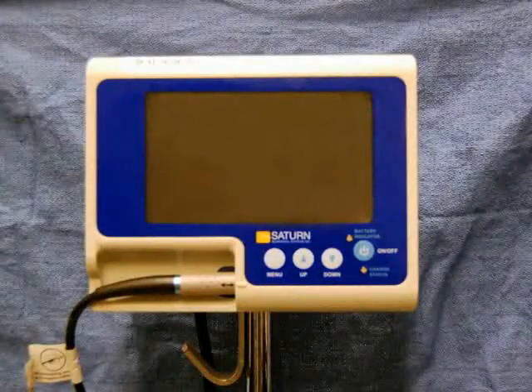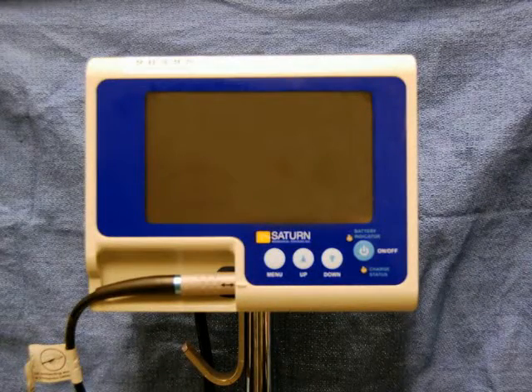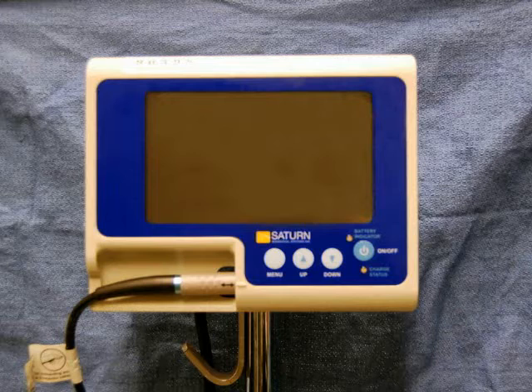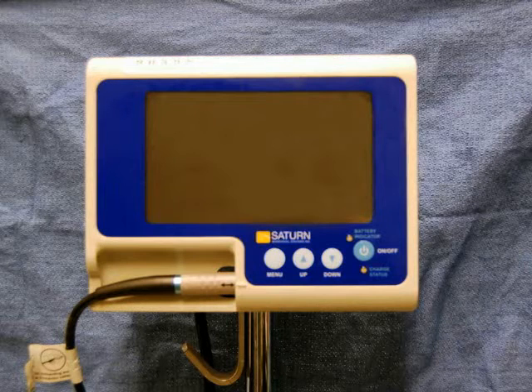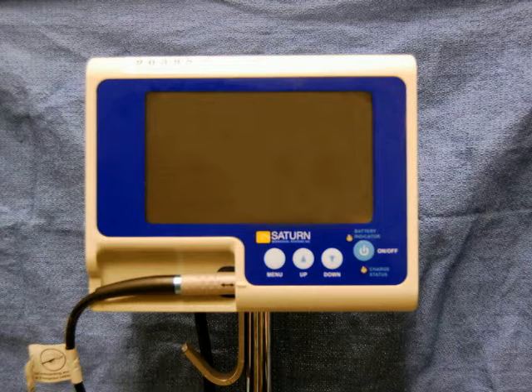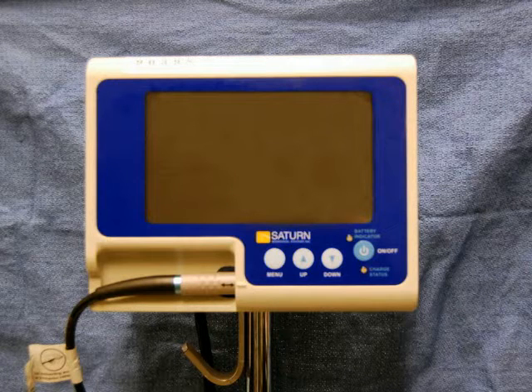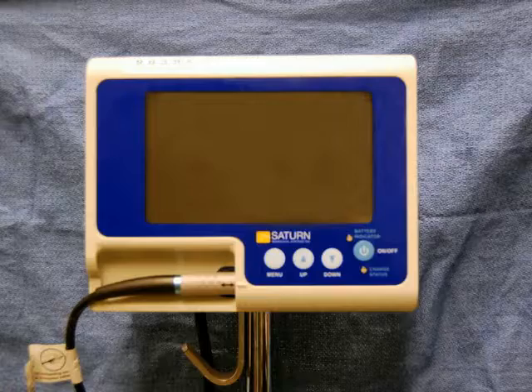Ensuring airway equipment is available prior to the procedure is critical to a successful intubation. Obtain the GlideScope video laryngoscope and check to ensure that both the screen and camera are functioning.